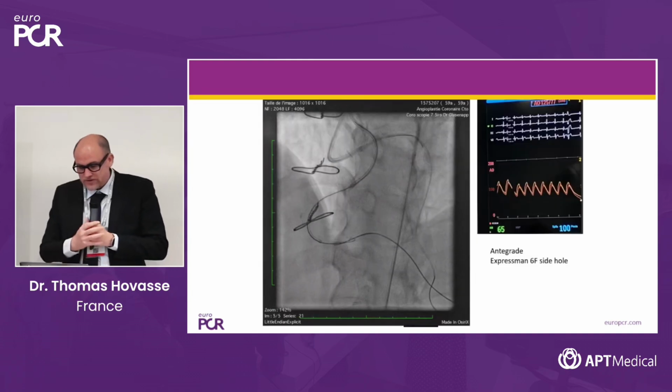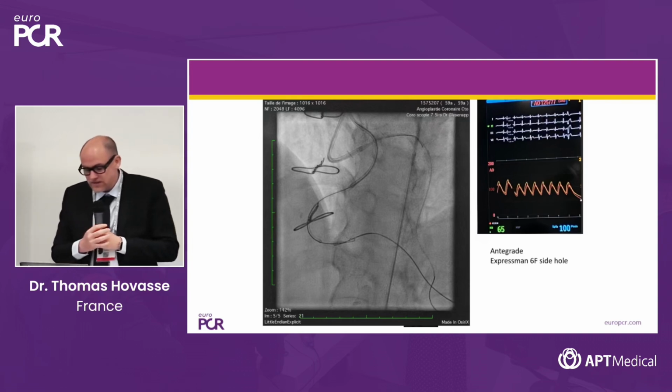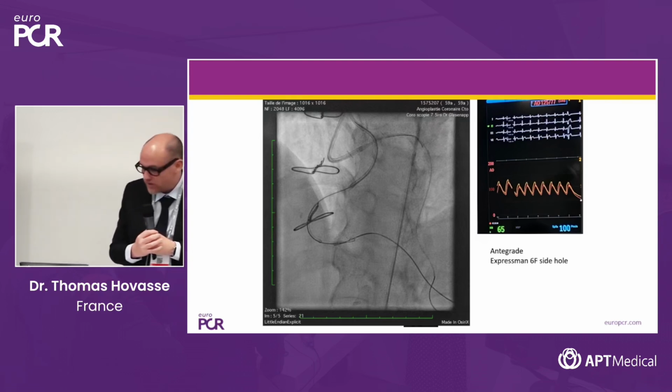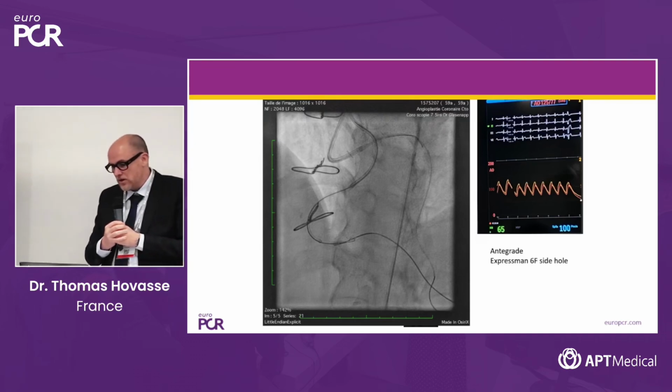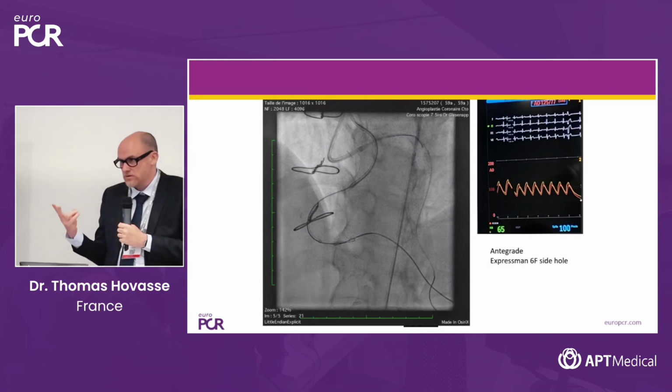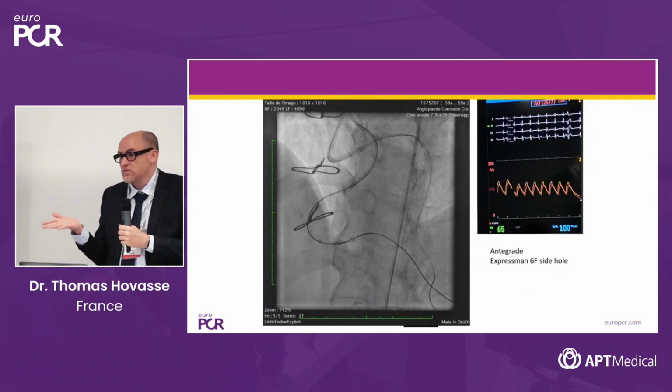So the reverse cart, and you see the other device which is interesting here is the extension guiding catheter, the Expressman. And why is it interesting? Because the Expressman has side holes, and it's really impressive to see the pressure, which is almost never dampened with the Expressman deep in the artery.